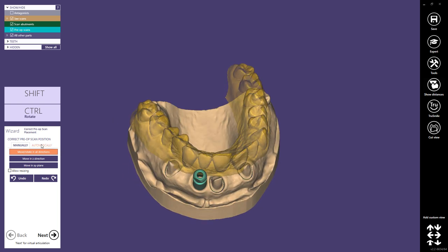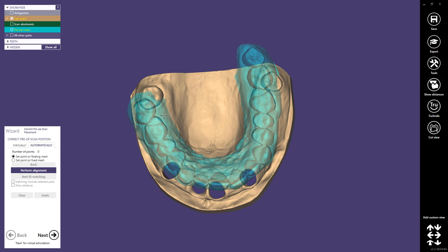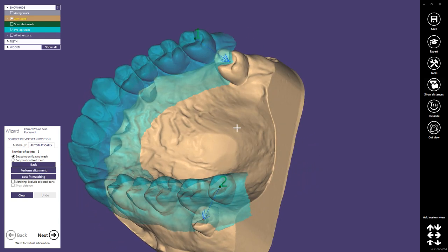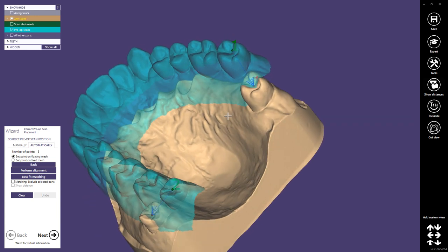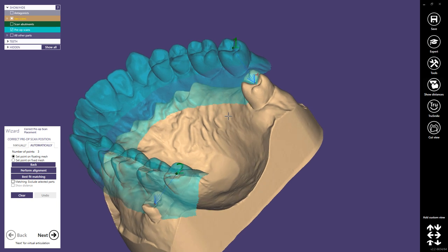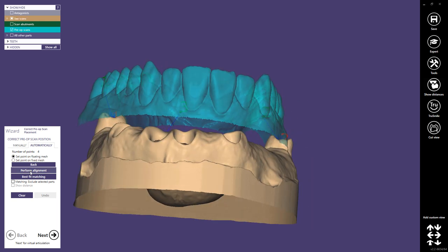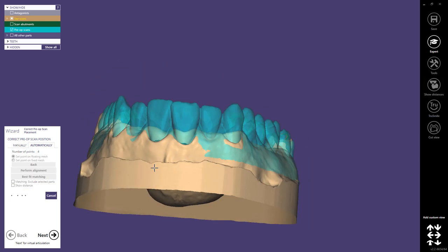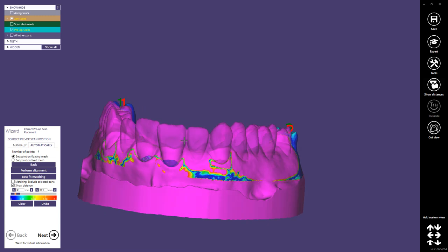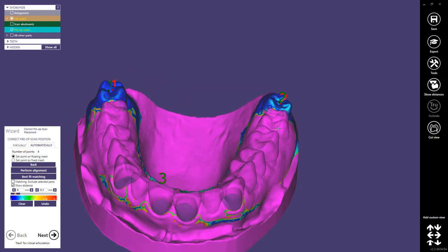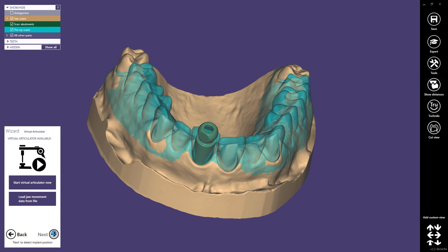I recommend to use the automatic placement. Here we can do a three-point alignment. I usually choose to do that on existing teeth because that's the best reference. As we don't have any other reference on this model, I choose a significant area on the papillars. Then we can do the alignment and perform the best fit matching. We check the result on the existing teeth — as it is displayed in blue, it's perfect.